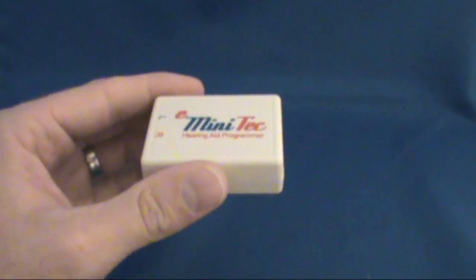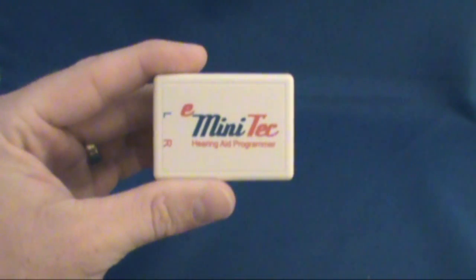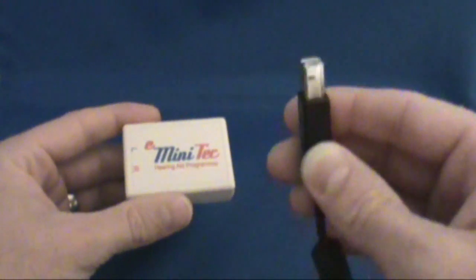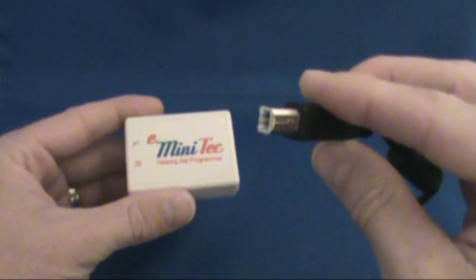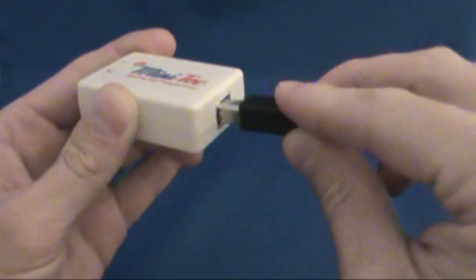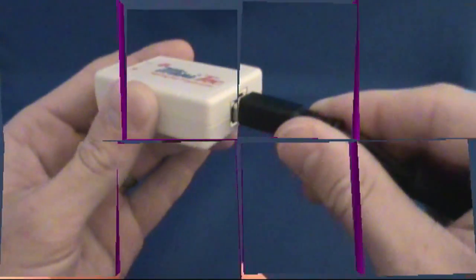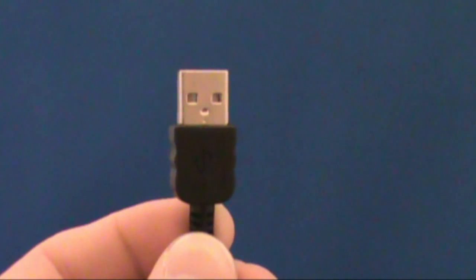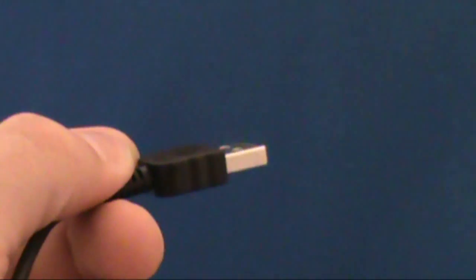First we'll connect the e-minitech to the computer. Using the provided USB cable, take the B end and plug it into the appropriate USB port of the e-minitech hearing aid programmer. Then connect the A end of the USB cable to the USB port on your computer.